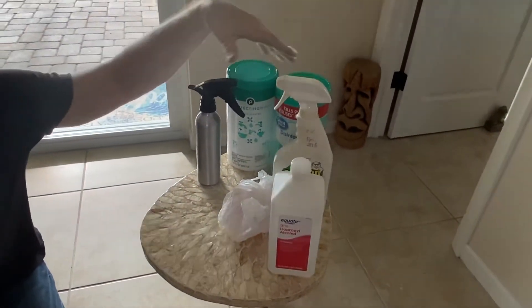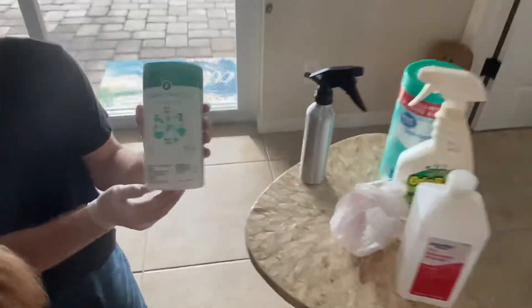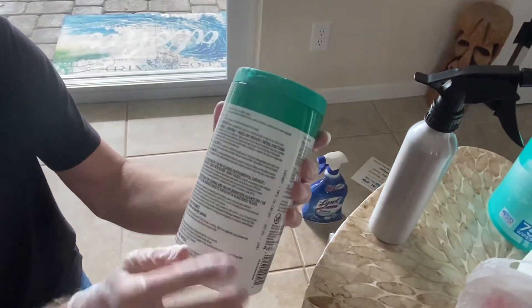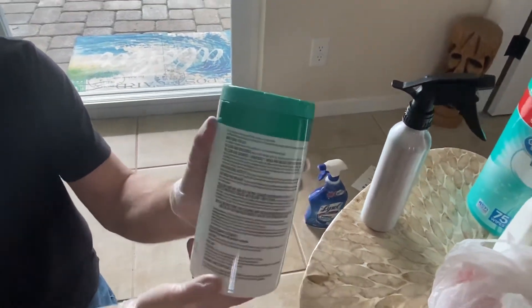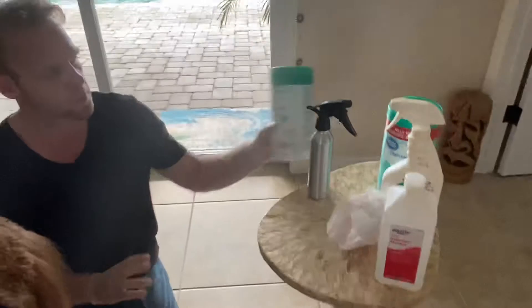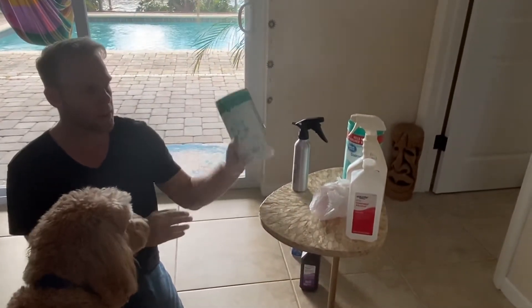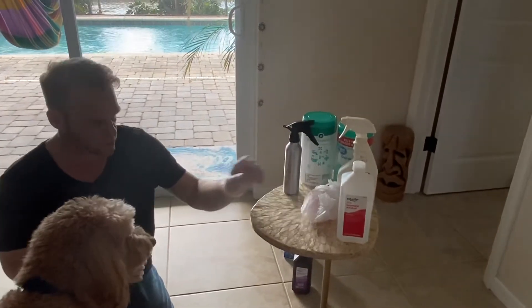Disinfectant wipes are great. The main thing is to understand the different types of germs they kill. These kill 99.9% of viruses and bacteria, which makes them a pretty safe bet. We'll get into this in just a little bit.